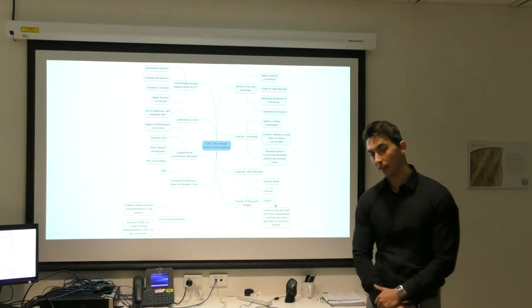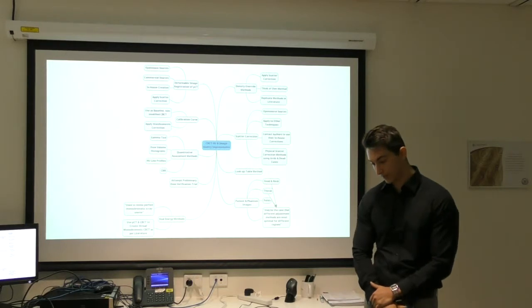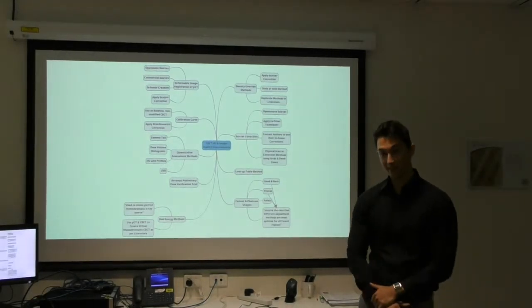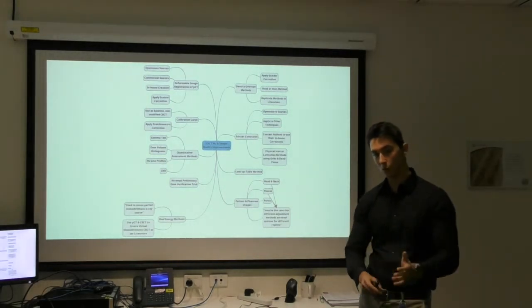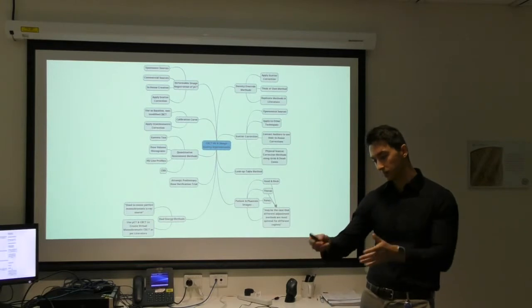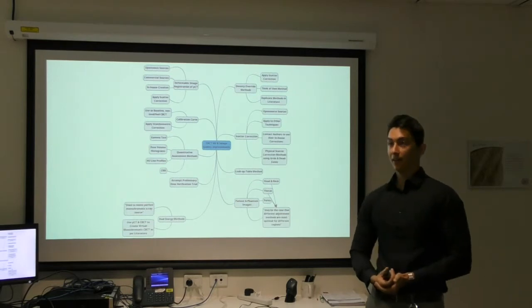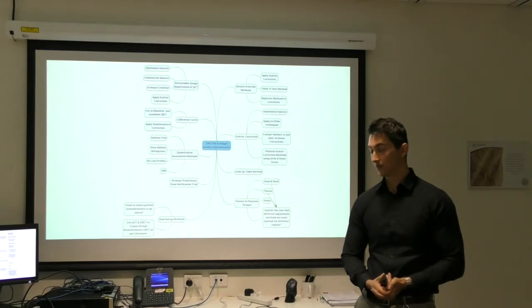So, yes, I think the time constraints for medical physicists and radiation oncologists to delineate the organs for every single CBCT are a problem. As with the previous treatments, they had a library of plans, small, medium, and large contours, and they overlaid that onto a newly delineated CBCT, and then they see, okay, this plan fits better, therefore I'll use it. And they did come up with better results. However, I think the time taken to delineate all of those new CBCTs puts everyone under stress.